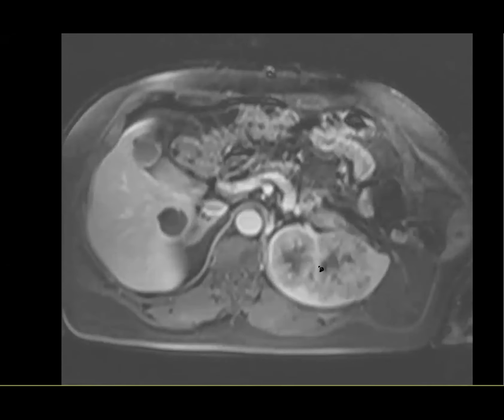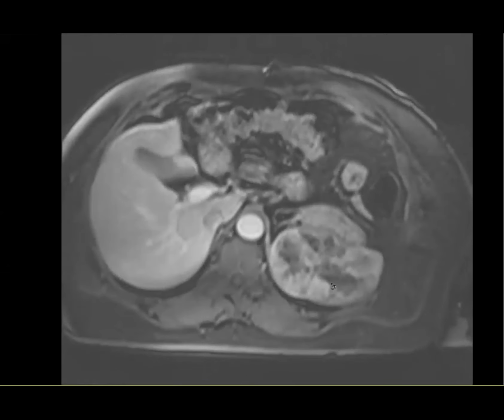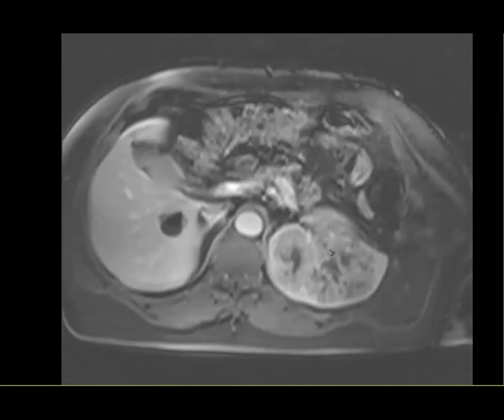But the urologist said, hey, aren't most splenic lesions benign? Like every time we get an incidental splenic lesion on our MRI reports, you guys tell us you don't know what it is, but it's likely benign. So why doesn't this fall into that category? And it was exactly what you said. This looks just like, the daughter here looks just like the mother. And therefore we suspect that this is a MET.